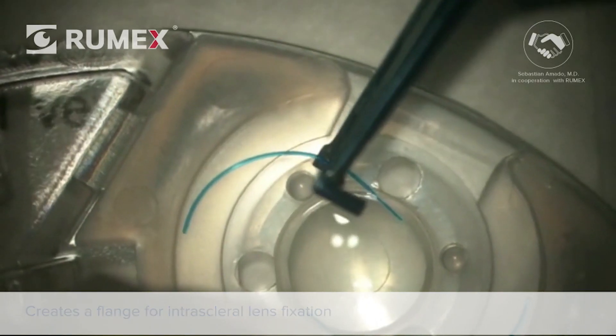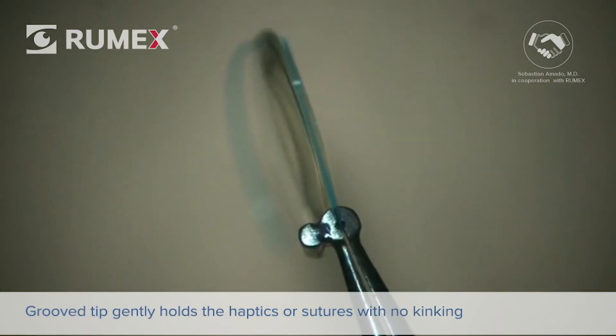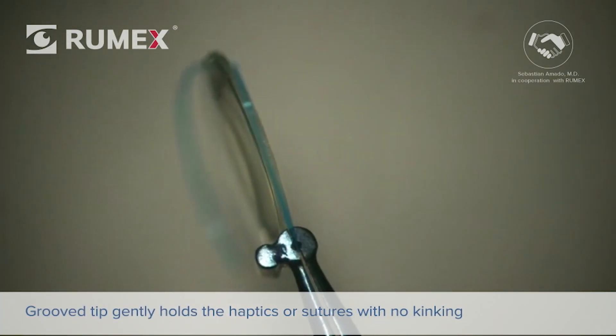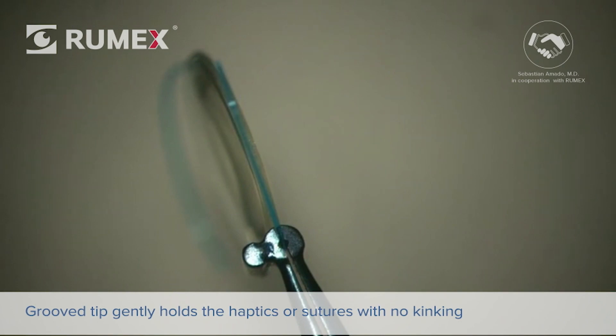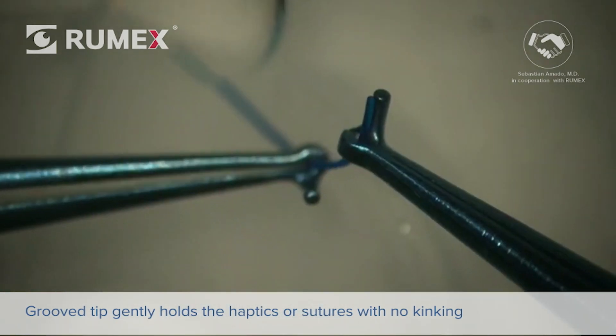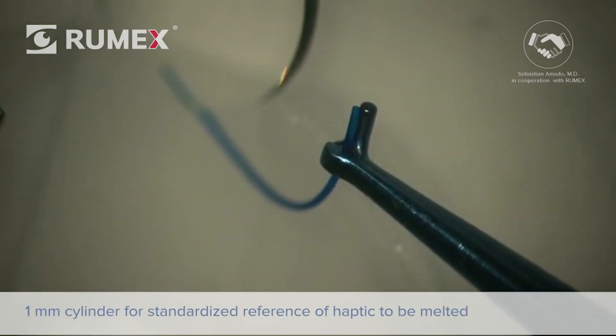It has several important features, starting with the presence of a 150-micron deep groove at the grasping end. This enables a gentle but firm holding of the haptics, especially those which tend to kink more easily, for example, PMMA ones.